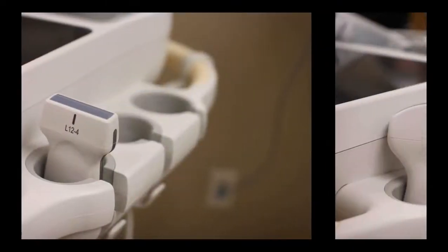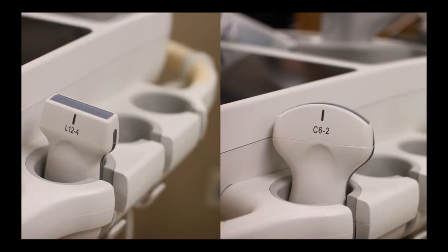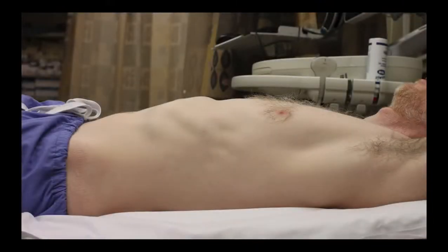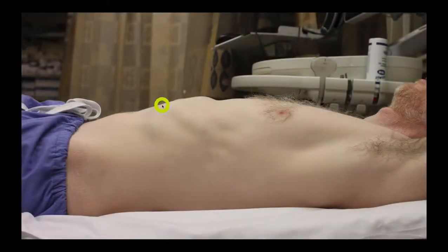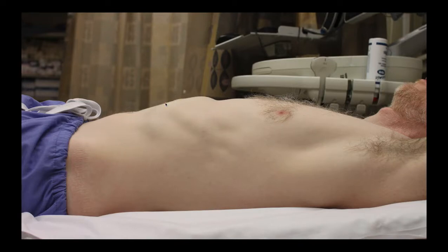The best probe for this is going to be your linear transducer. It's going to give you the highest resolution image, but the curvilinear transducer can work as well. As far as where to place the probe on the abdomen, the most anterior part of the abdomen would probably be the first place that I'll look, but you can look all over.